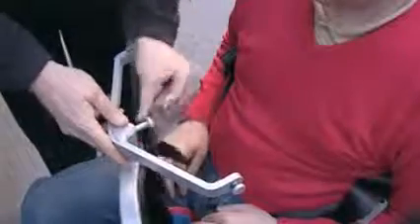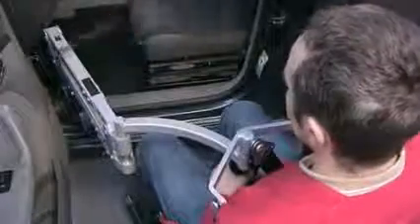The person is then wheeled up to the spreader bar. The sling is then attached, leg straps first, then side straps. The person is then lifted clear of the wheelchair using the remote control.